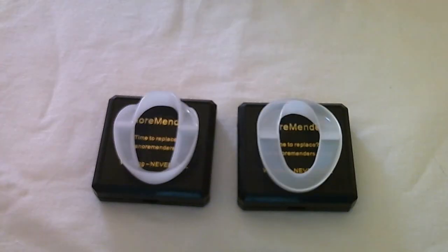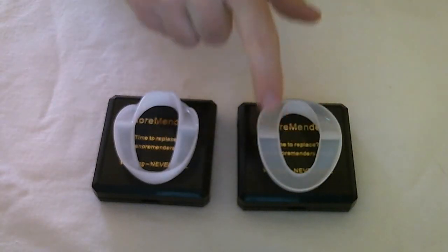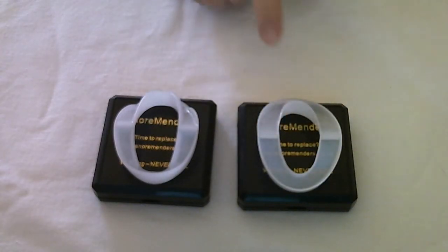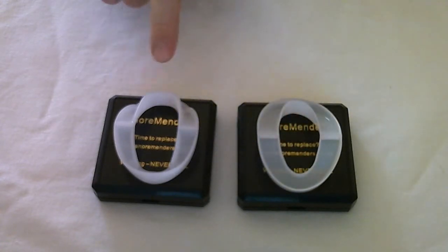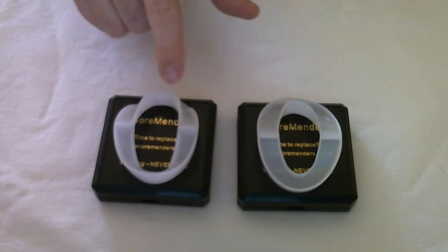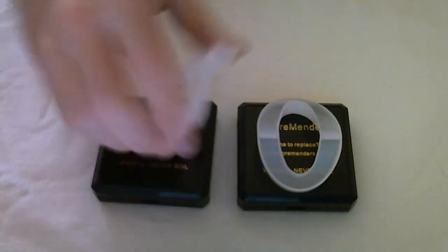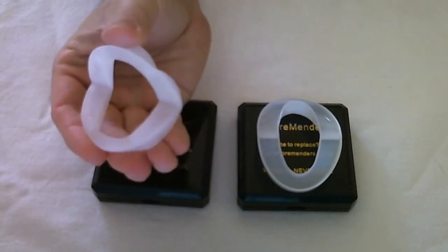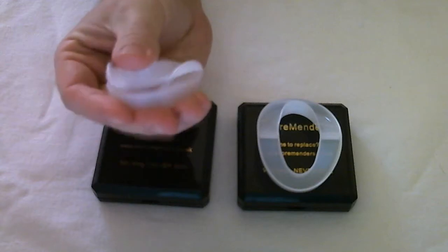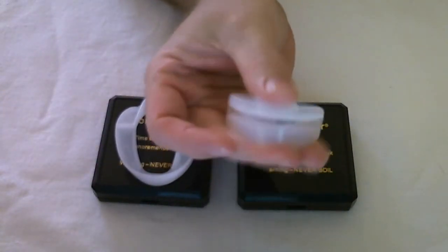Let's start by comparing the overall thickness of the two devices. This is the original, and you can see the walls are a bit thinner, and this means that the edges are somewhat sharp compared to the newer model where the material is a bit thicker and the edges are more blunt. The newer model is thicker, so there's more resistance as far as opening and closing, while the original is thinner and there's less resistance.